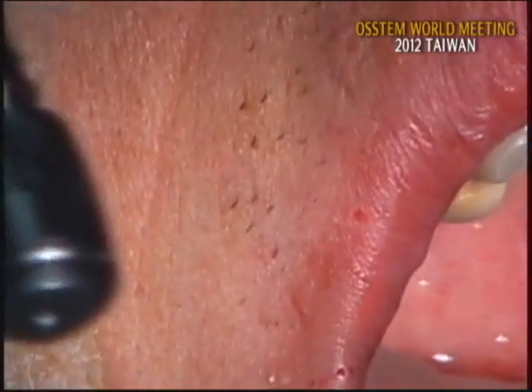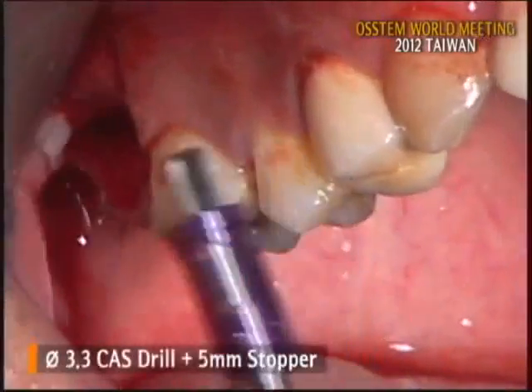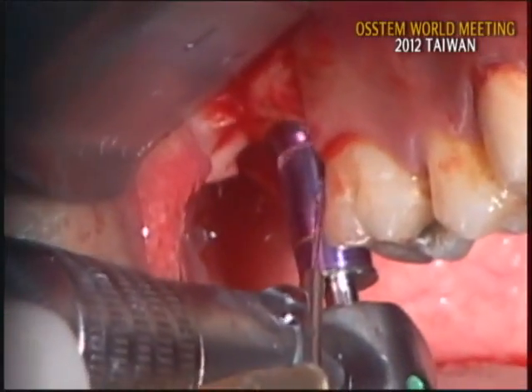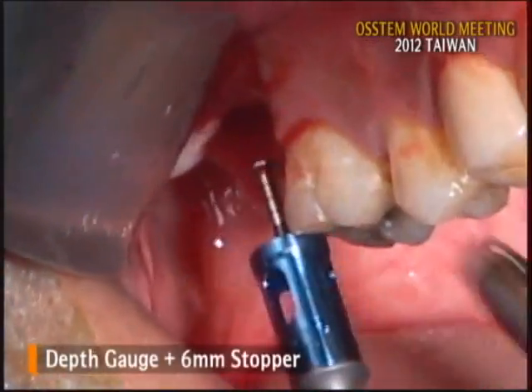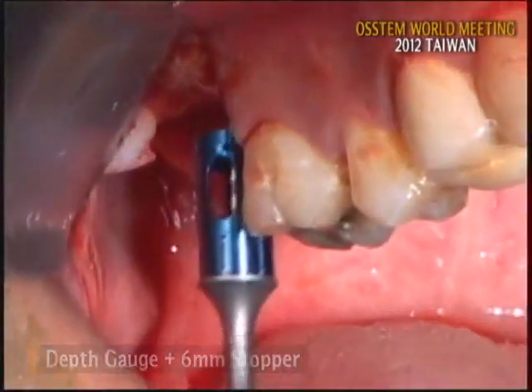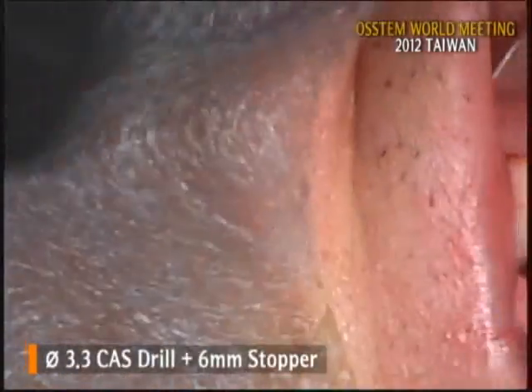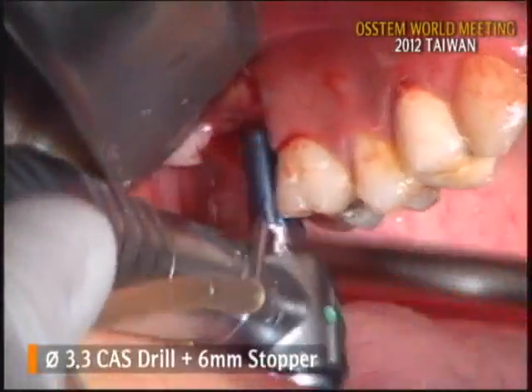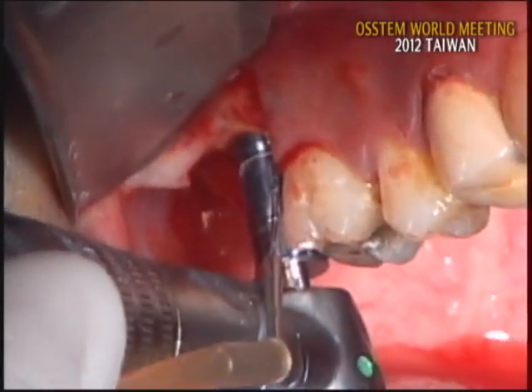So I will change the stopper to 5 millimeter. With the same site. Go. It is better to check with the depth gauge. I cannot touch the membrane, so I will advance the drill 1 millimeter more. The stopper is 6 millimeter. Some dentists like low speed, but I like high speed RPM.